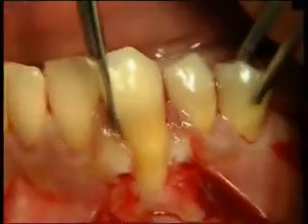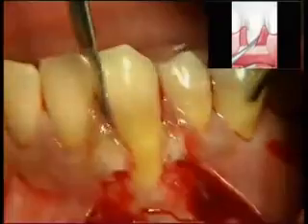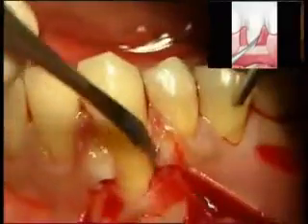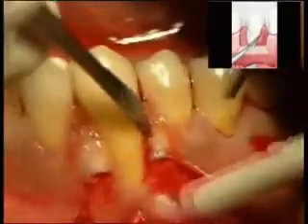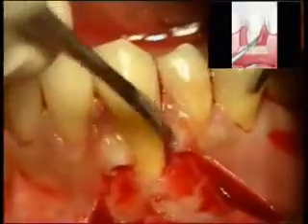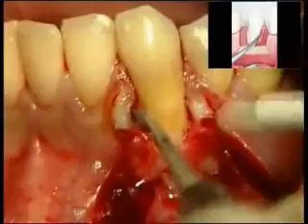After having made an intrasulcular incision, the papillae are raised, firstly with a 15C surgical blade, and then with a CTGO to create space underneath the tissue and to maintain the most coronal part of the membrane in firm, direct contact with the underlying bone surface.